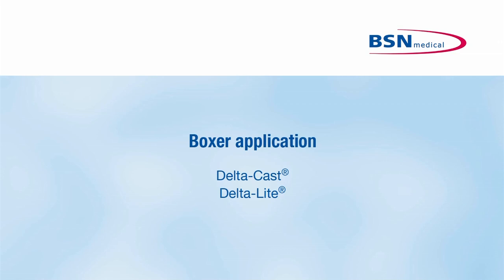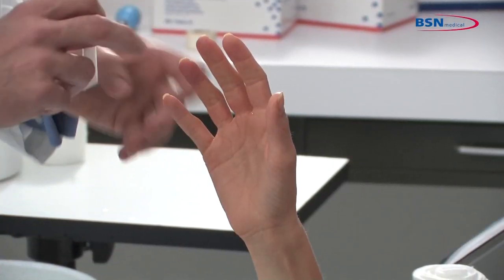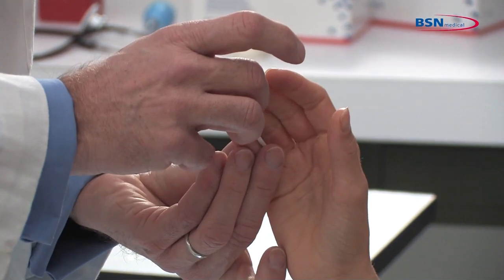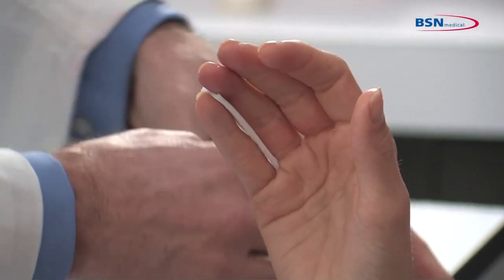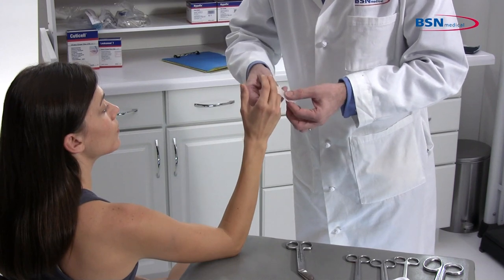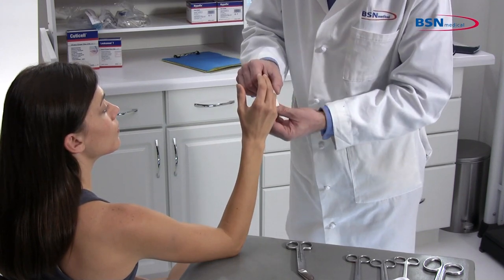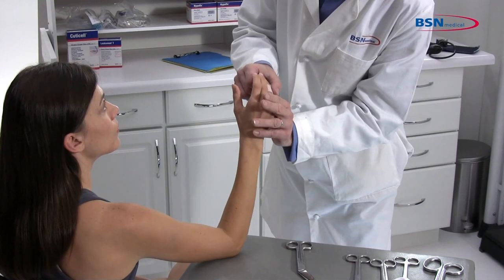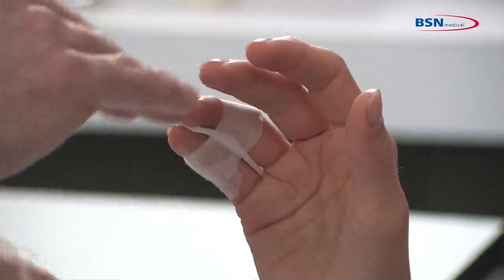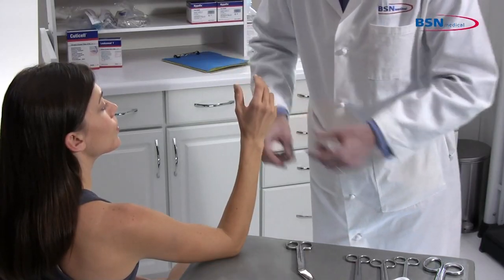The Boxer Application. For indications where immobilization of the metacarpals and wrist joint are required, position the limb before starting the application. Place a small piece of folded padding between the fourth and fifth phalange to provide cushioning. Tape should be used to keep this in place. Placing the limb in the proper position will assist the patient in maintaining that position during the application. Follow physician's instructions on the proper positioning of the limb.